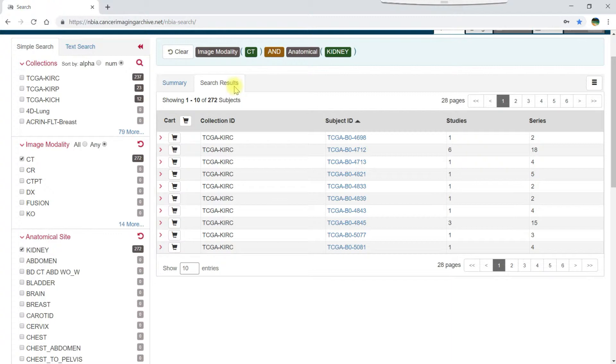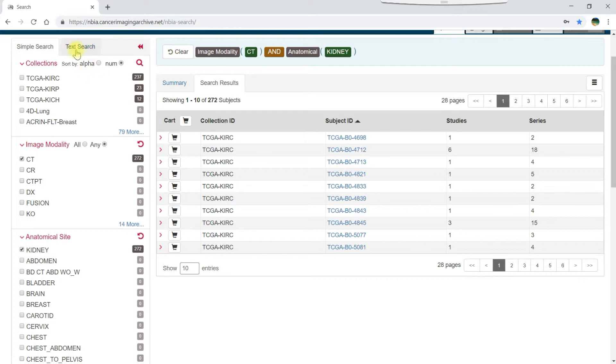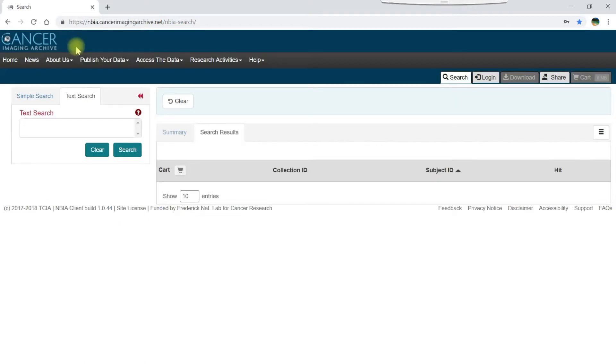In addition to using the simple search filters, you can also search the data portal using text search. To do this, click the text search tab and enter your keywords of interest.